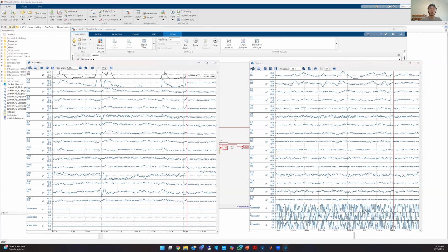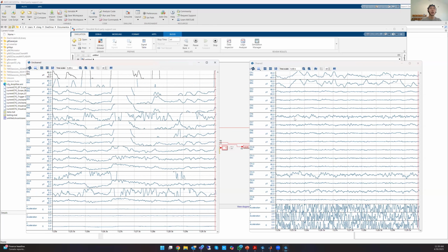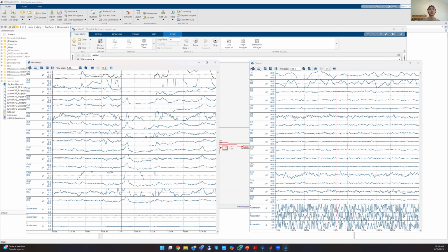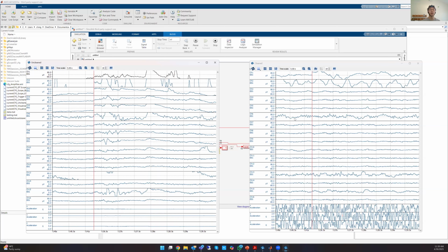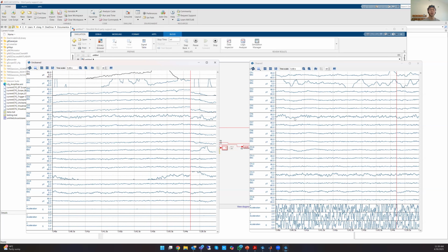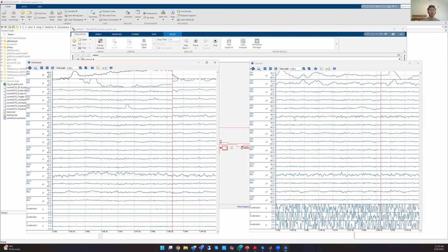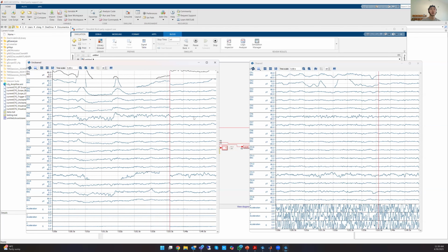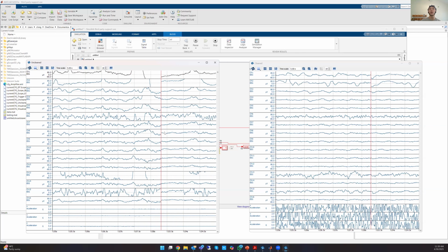So there are some tests you can do for confirming the EEG signal. The first thing will be to ask the subject to relax first, close their eyes, to see if there is any alpha wave. Okay. So if you notice the data, there should be a small little bump for the alpha wave.